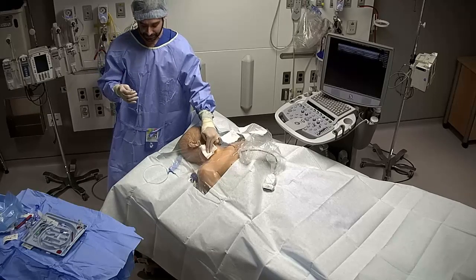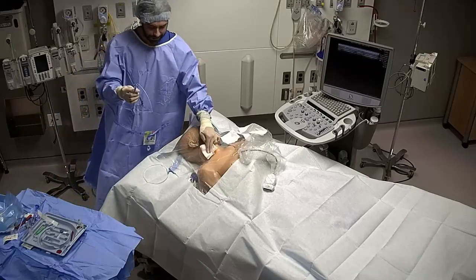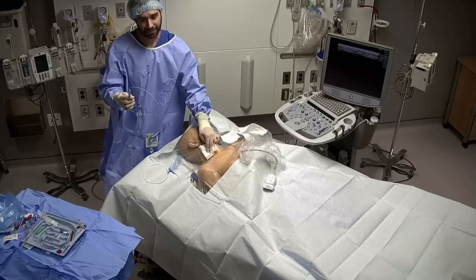Once that's done, I'm going to take my triple lumen kit, and if you have a 15 centimeter catheter, you're going to hub it.